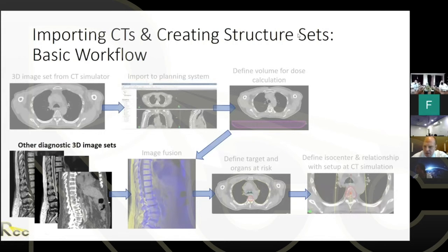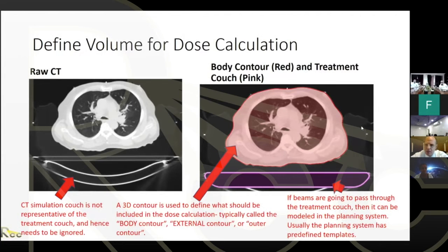Yeah, and metal artifact reduction. There's a good question about metal artifact reduction. Yes, you can use metal artifact reduction. One thing to note is that a lot of those algorithms are iterative, and they can have some limitations. So you should look up the metal artifact reduction algorithm, and often they'll tell you not to use it if the metal is next to air or low density or something like that. You should just be sure that you're aware of the limitations, but it certainly can be very useful to deal with those.